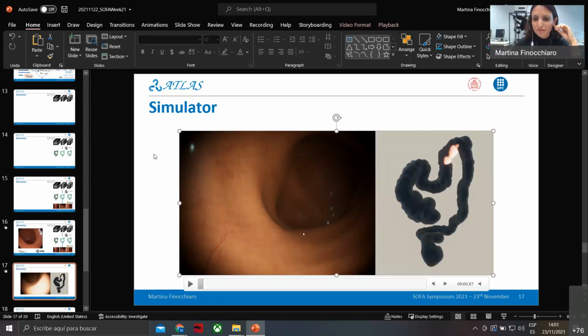Yes. One of the difficulties, if I understand well, is probably to drive the robot inside the, sorry, not vessels, the colon. And does the surgeon have full control of the robot, or is it completely teleoperation, or do you predefine a trajectory to avoid any collision with the walls?